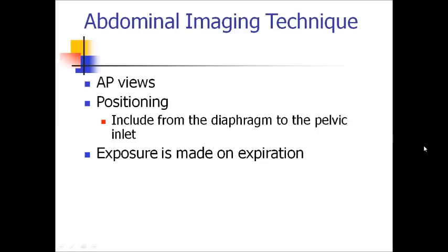Usually anterior posterior films are performed in abdominal imaging. Right position of patient is necessary. It may include patient from his diaphragm to the pelvic inlet, and exposure is made on expiration. As you remember, on the contrary, chest X-rays are performed on deep inspiration.